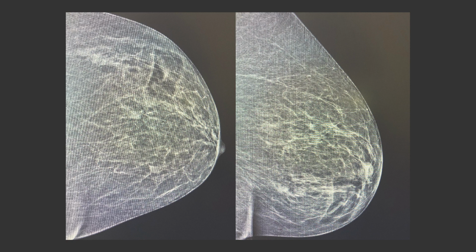Here are two more mammogram images just showing a reflector within the breast. In the left image, you can see it centrally within the breast. And then on the image on the right, it's lower in the breast.